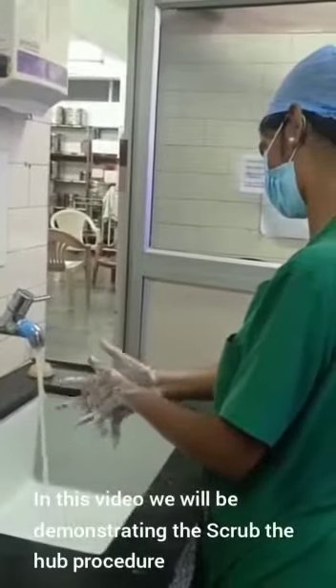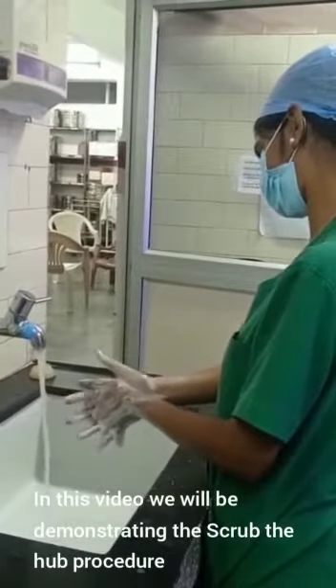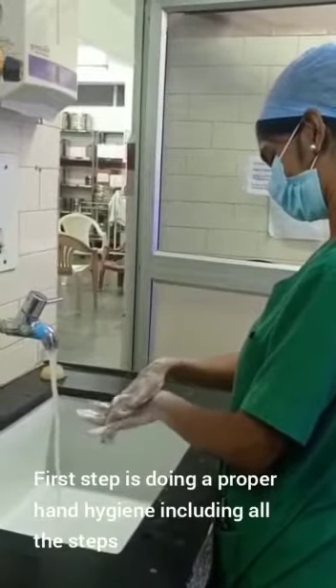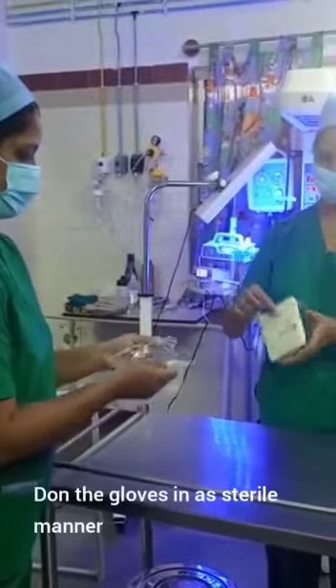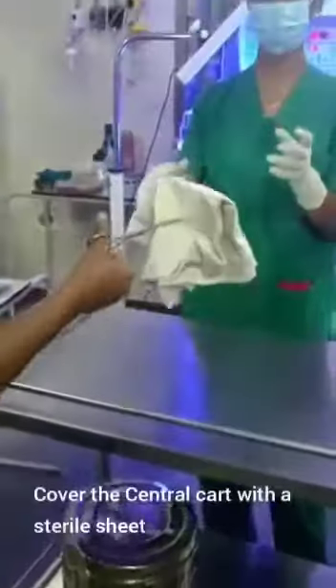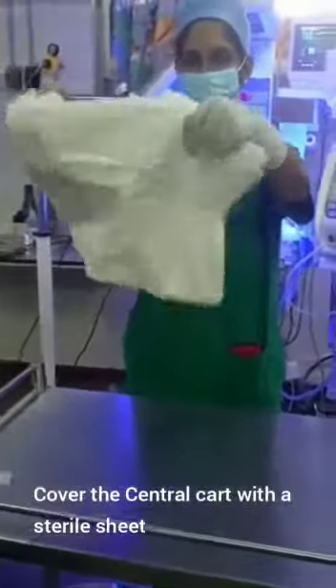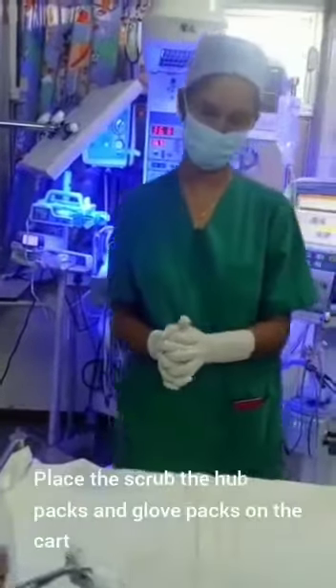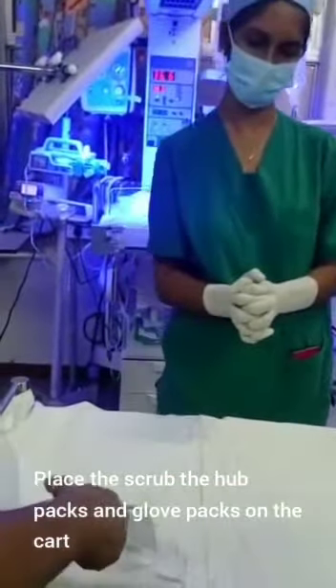In this video we will be demonstrating the scrub the hub procedure. The first step is doing proper hand hygiene, including all the steps. Don gloves in a sterile manner, cover the central cart with a sterile sheet, and place the scrub the hub packs and glove packs on the cart.